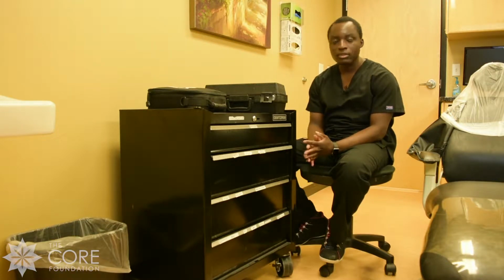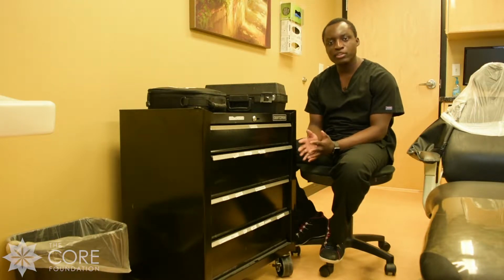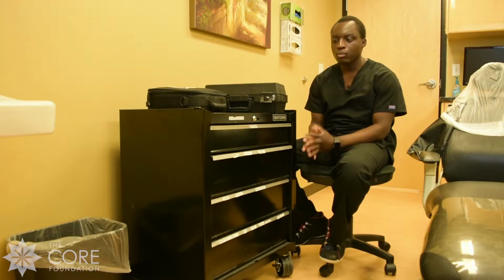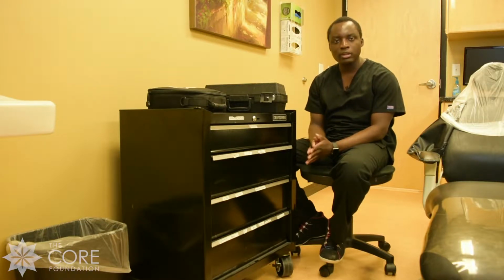I highly recommend when you go into your office, you talk to your practice administrator, your doctor, or anybody in charge of the office on where you keep the crash cart, what instruments go in there, and what they prefer for it, and also who they want to track the medication in it. Like I said, you never know when any emergency will happen, and you really want to make sure you know everything about your crash cart.